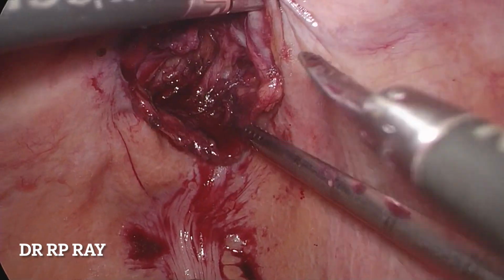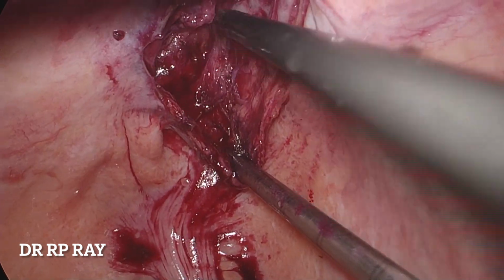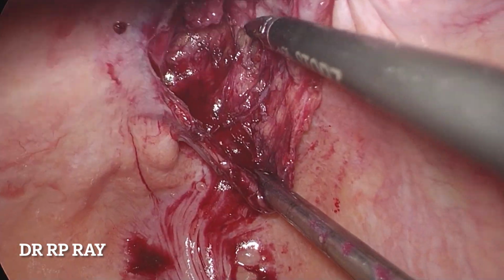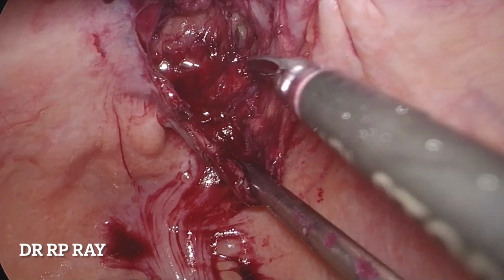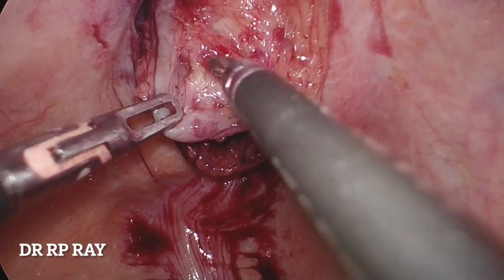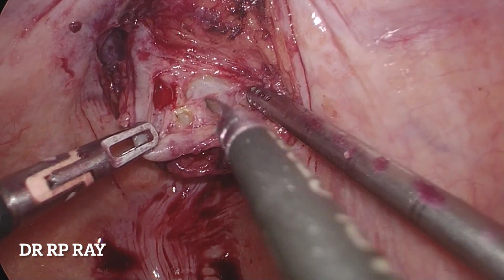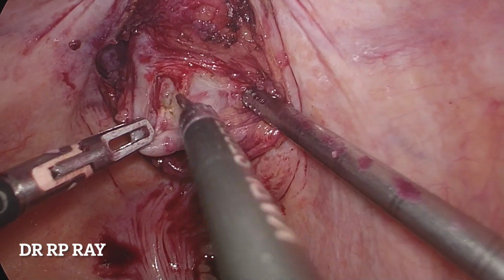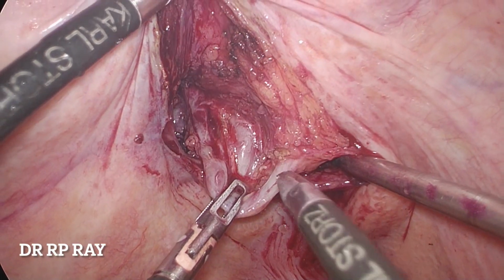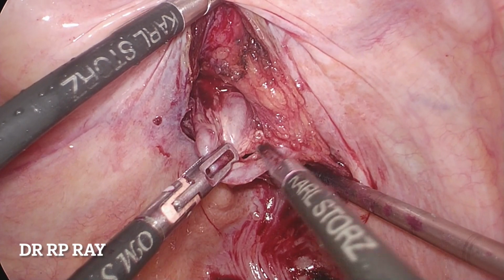The circumferential dissection should be continued from posterior, from anterior aspect. These fascial attachments are dissected out, and seminal vesicles are freed entirely. So this is the right seminal vesicle. There may be some small vessels that can be easily cauterized by the monopolar or bipolar diathermy. You can see here the right vas is separated from the surrounding structure.